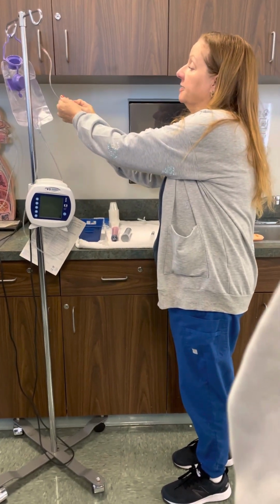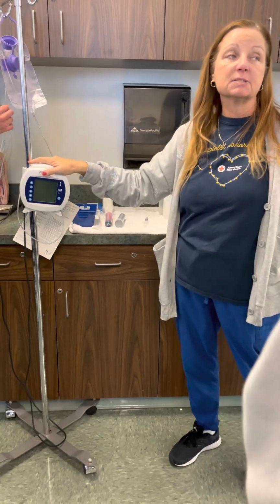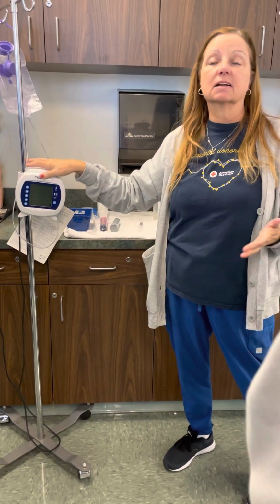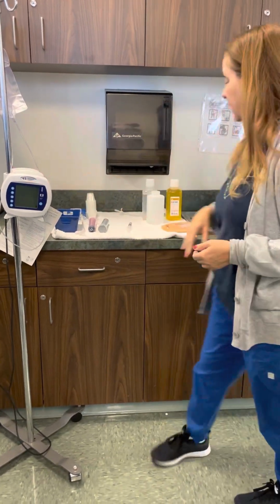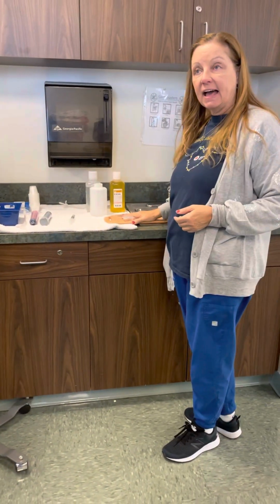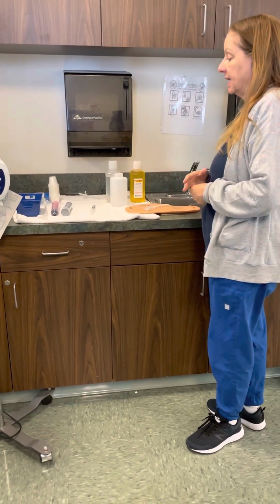medication together. So often what will happen is you may get an order to stop the feeding 30 minutes before you're going to give meds. So if I'm giving meds at 10 o'clock, I'd turn this machine off at 9:30, and then I would let the patient's belly have a little rest, and then we would go ahead and give our medications.